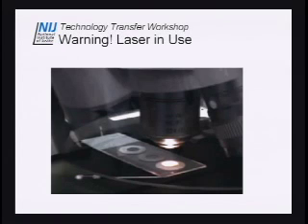So again, I talked about this before. This is my homemade video. This is what it'll look like. You'll see the pen slide down here. And you see those little circles? Those are just circles I put on there so I know where my sample is sitting. I use simple office Avery labels, the kind you use for reinforcement of your 3-hole punches. That makes a 7 millimeter spot, which a lot of people like as a working volume, and I put 3 microliters in each of those. In addition, those little labels are helpful when you're staining, to put your drop in there, and it holds the drop so you can easily stain it.